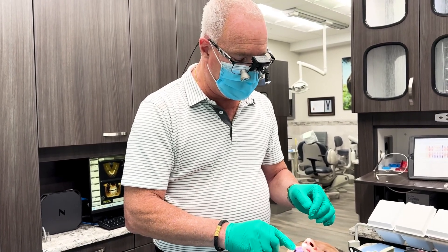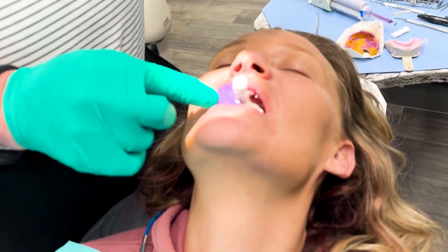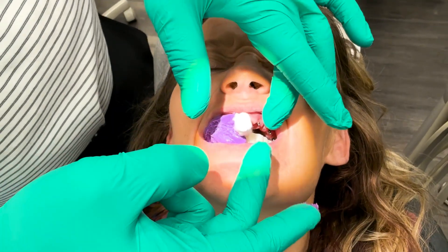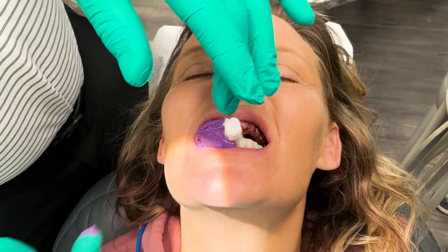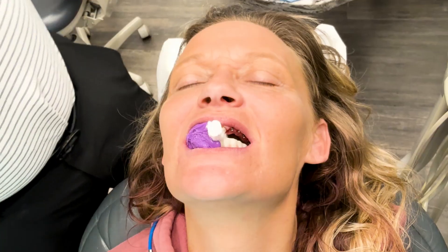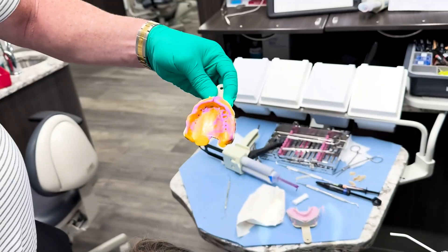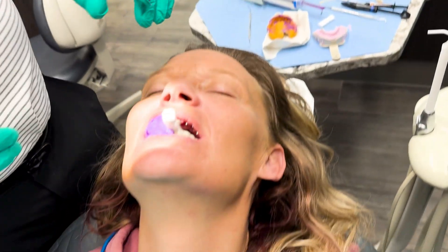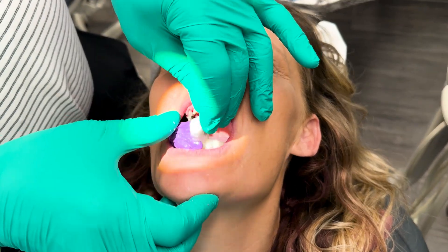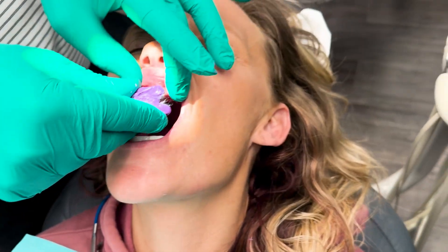We'll give this another 30 seconds or so — keep biting. This is a combination upper and lower roundhouse. On the top, we have a few natural teeth and some implants. On the lower, it's a full arch of implants. We took the final impression for the upper roundhouse here. On the lower, we're letting that heal a little bit longer. Okay, so this is set now — you can open. So now we're going to just take that cotton out. I'm going to put this back in.